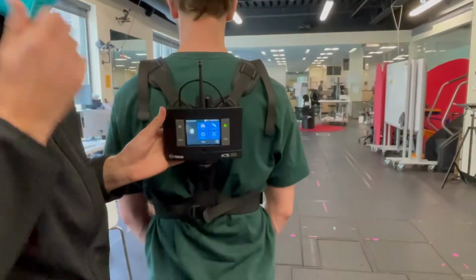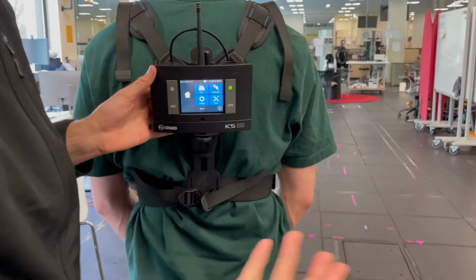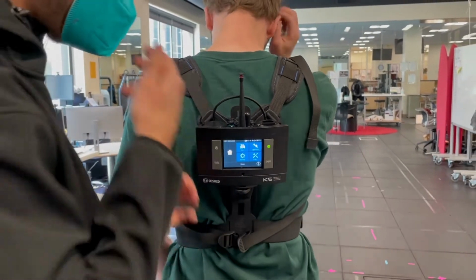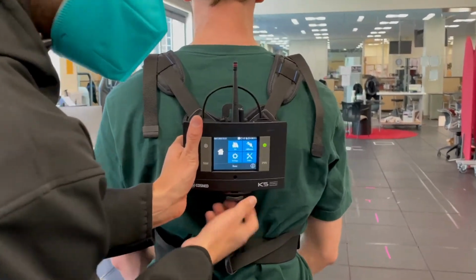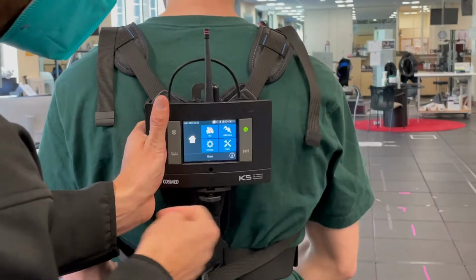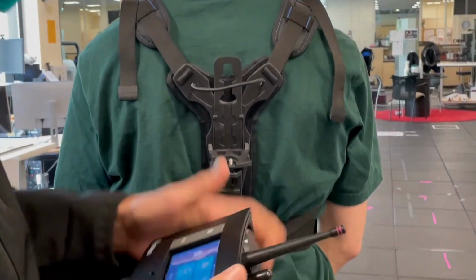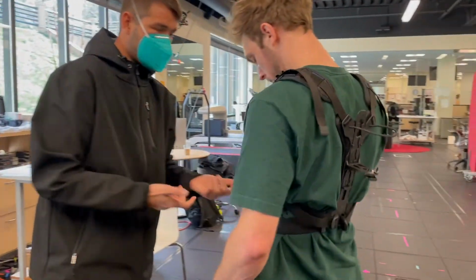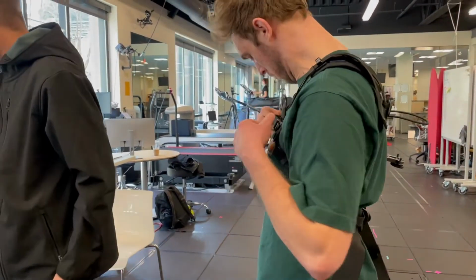I just like to do it that way where I pull that off because I don't like things dangling and you run the risk of dropping it. So I like to make sure that I pull that off first. Perfect. Set this guy here. And yeah, we can go ahead. You can go ahead and pull that guy off.